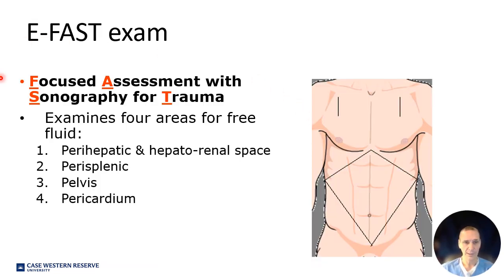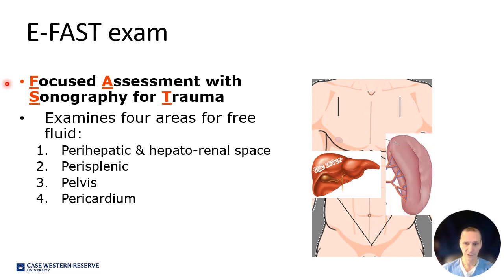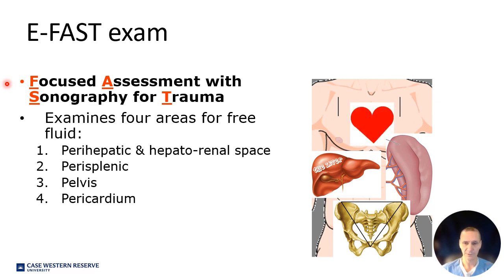All right, so what is the eFAST exam? eFAST used to be called the FAST exam. FAST stands for Focused Assessment with Sonography for Trauma. Basically we're looking at 4 areas when we do the FAST exam. We're looking around the liver, the spleen, the pelvis, and the heart, and we're looking for free fluid.